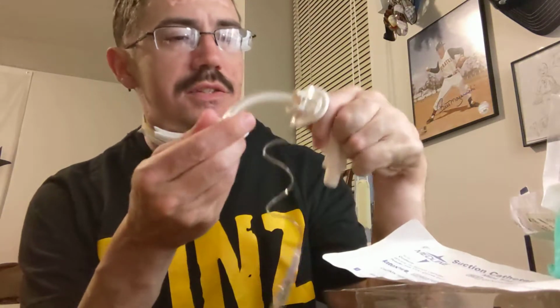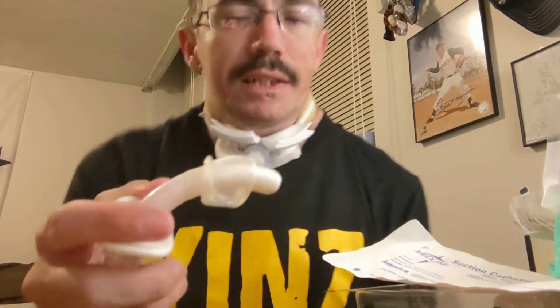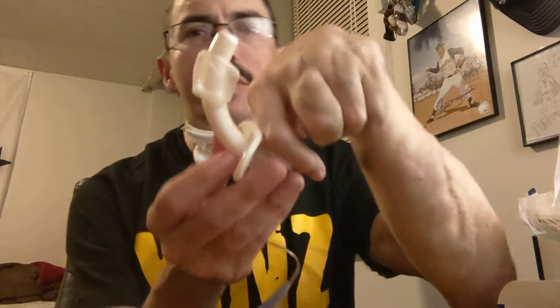So anyway, this is the Trach, and I've mentioned it before. I actually talked about it on one of my podcasts, and this is a packaging thing here. I talked about the balloon and how if you inflate it, it inflates this balloon. The Trach just goes into your throat, right where the trachea is.